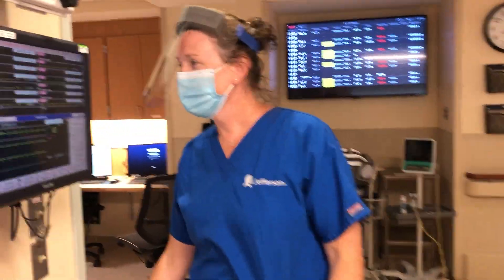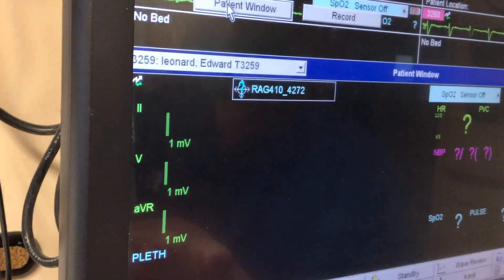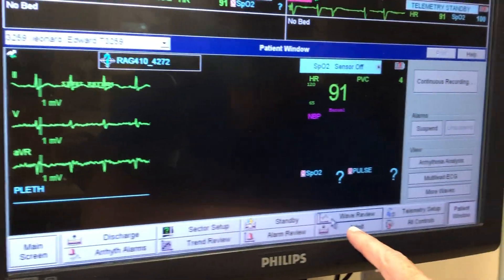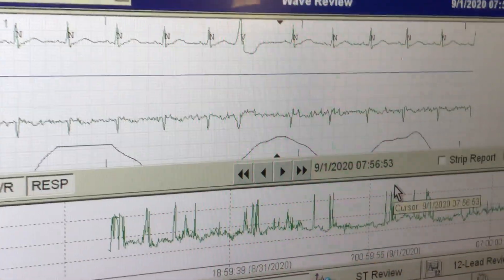Click on the patient window and it'll come up in real time. When you want to print your strip, go to wave review, and if you click on the last one it'll be the current time.